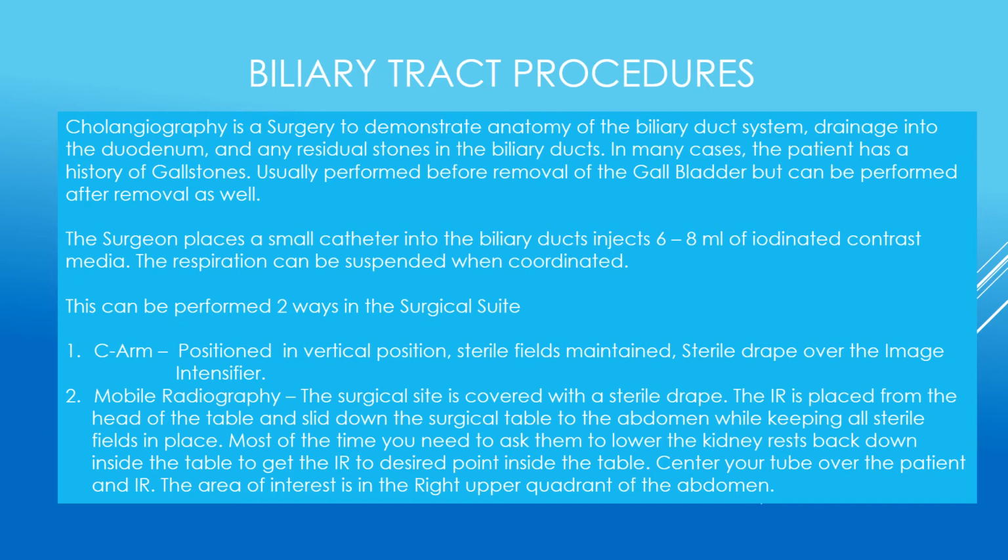This can be performed in two ways in the surgical suite. One, with a C-arm positioned in vertical position, sterile fields maintained, and a sterile drape over the image intensifier. Two, mobile radiography, where the surgical site is covered with a sterile drape.